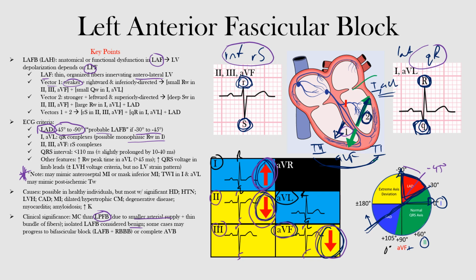Well, that's the end of this lecture. We discussed left anterior fascicular block, including its pathophysiology, EKG features, potential causes, and clinical significance. I hope you learned something.